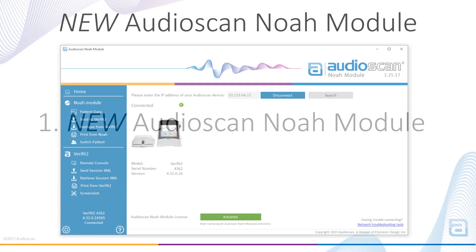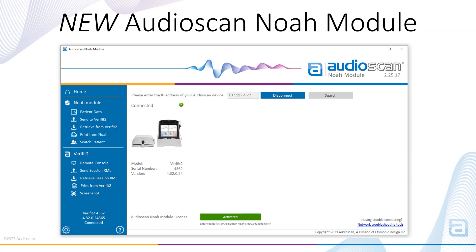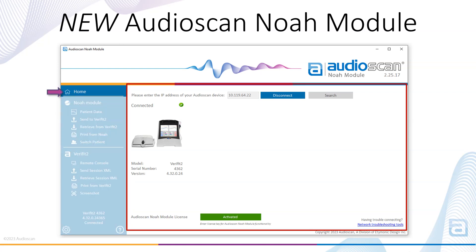The AudioScan NOAA module has a new user interface for optimizing workflow and ease of use. The Home tab is where you go to set up your AudioScan to PC connection. The AudioScan device IP address and the license key are entered in the Home section of the module. Once successfully connected and the license key has been entered and reads activated, the full module functionality will be available.